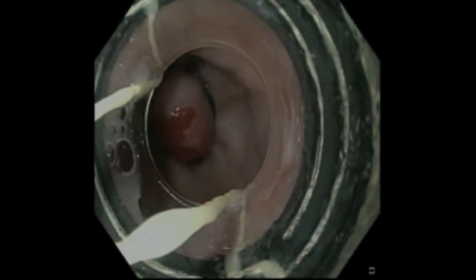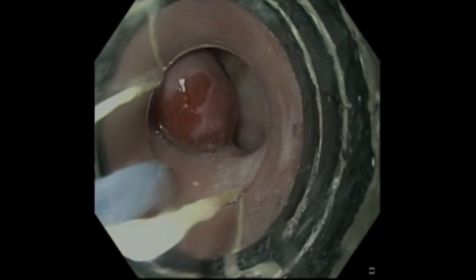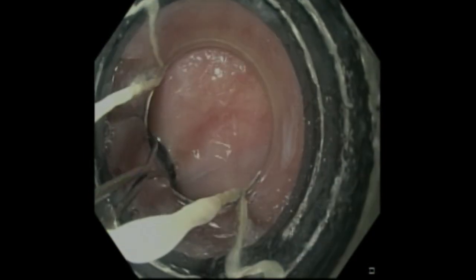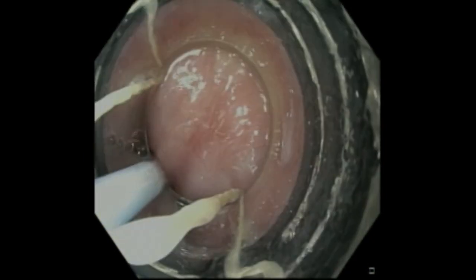Here the first resection is shown. The abnormal tissue is suctioned into the cap, a plastic band is deployed to create a pseudopolyp, and then this tissue is resected with the wire loop snare.